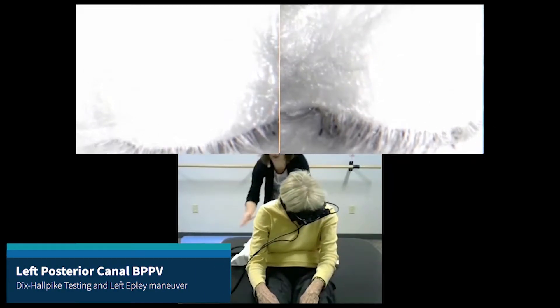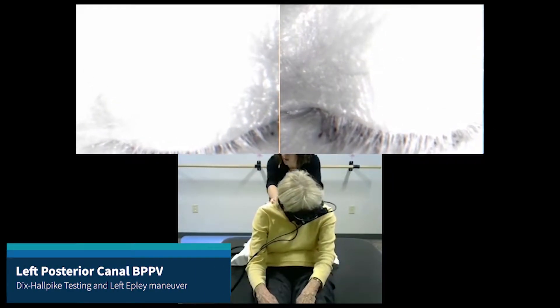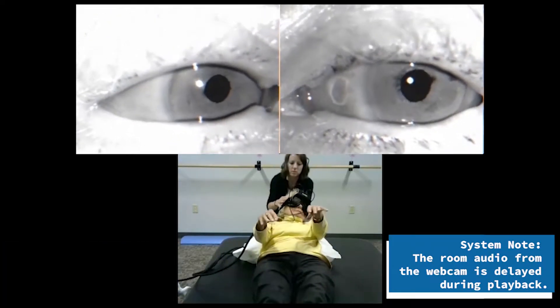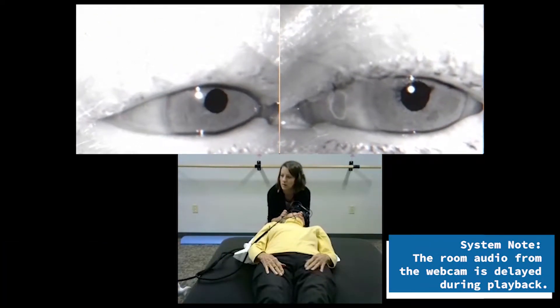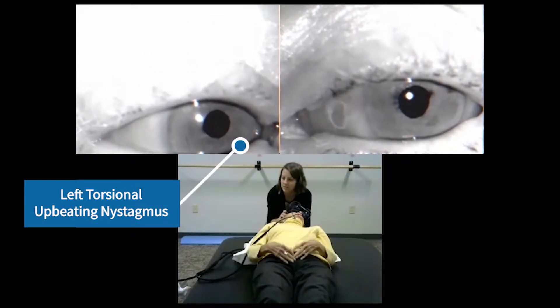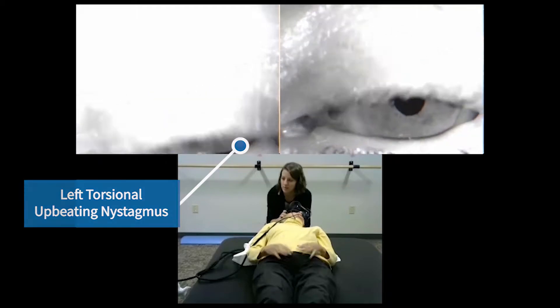Head to the left — on the count of three: ready, one, two, three, lie back, keep that head turned, and there we go.